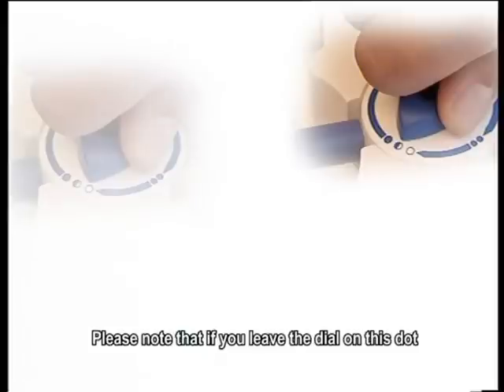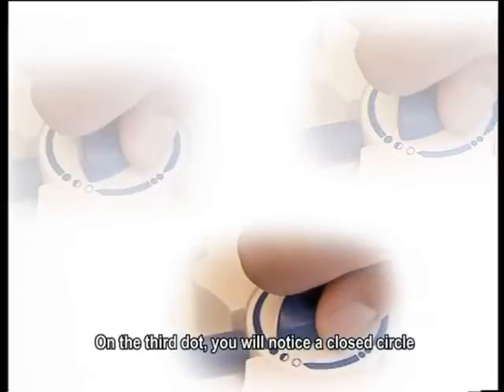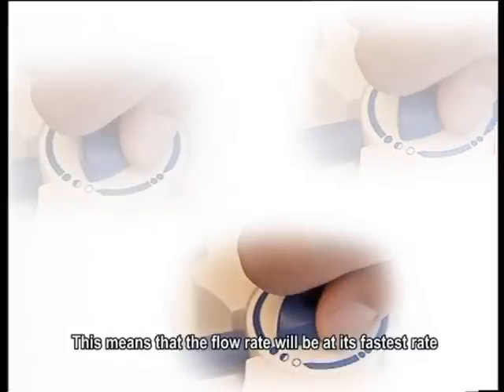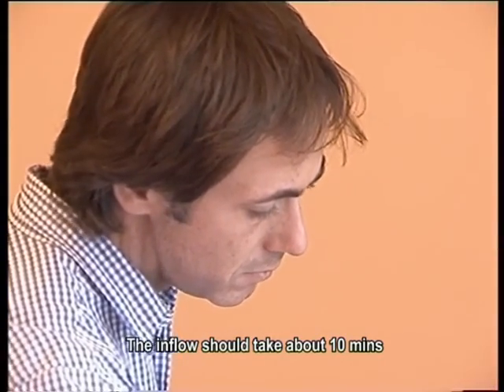Please note that if you leave the dial on this dot, the fluid will take longer to flow in. On the third dot, you will notice a closed circle. This means that the flow will be at its fastest rate. The inflow should take about 10 minutes.